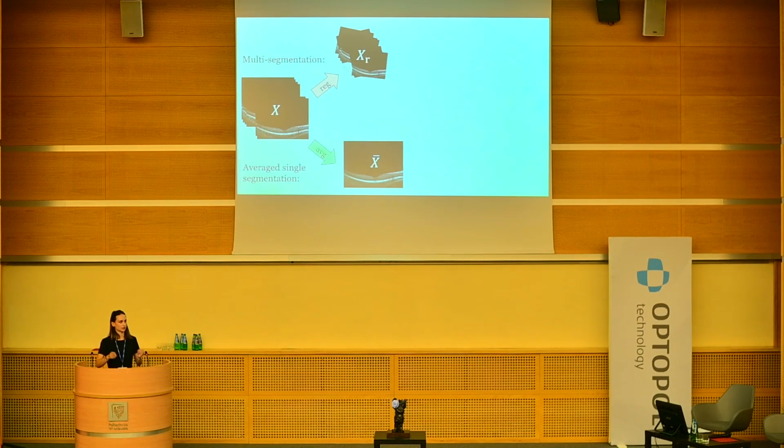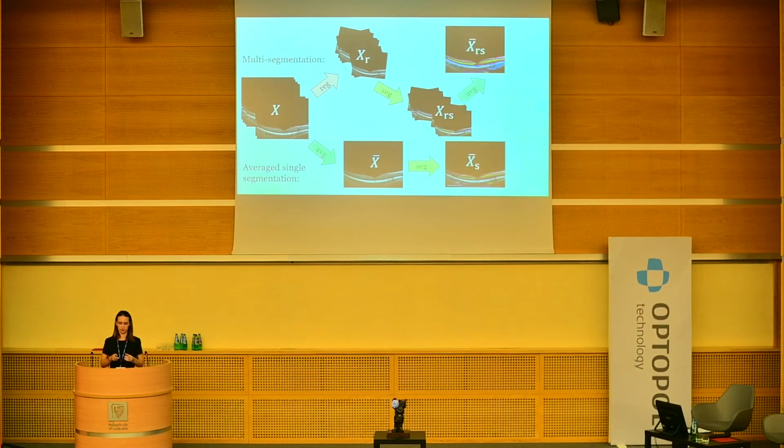And then, after that registration process, the segmentation can be performed on the individual retinal B-scans, and after that, the average result can be obtained.